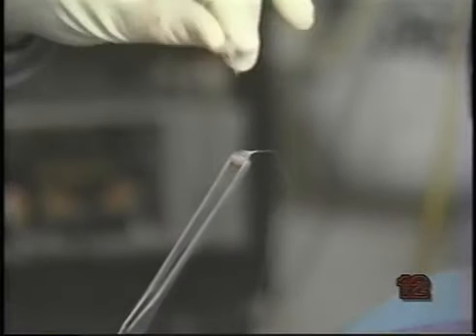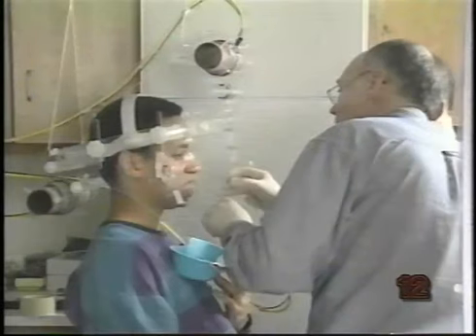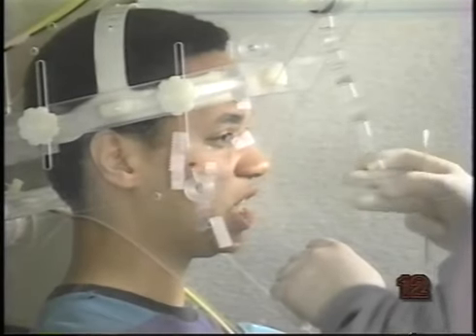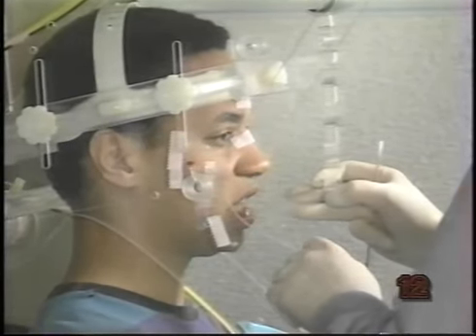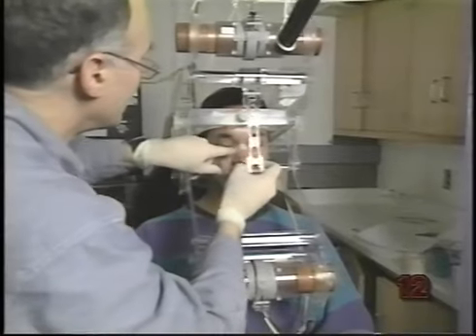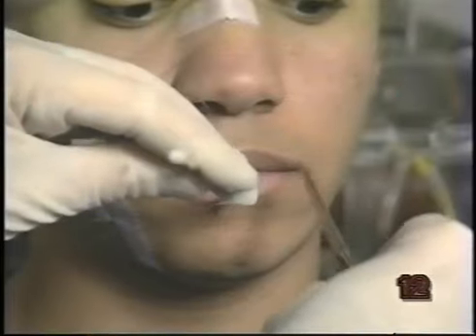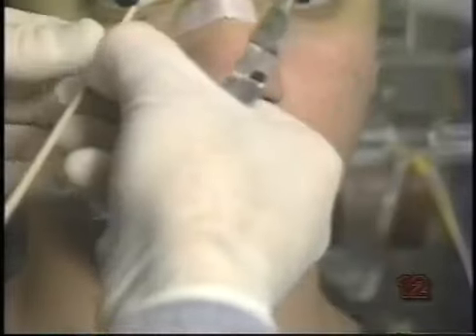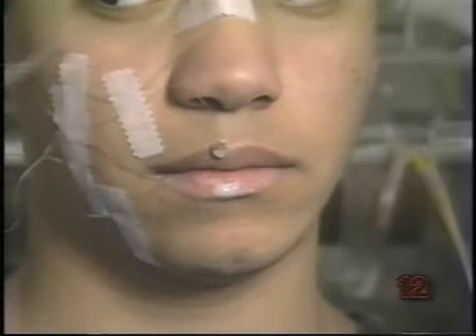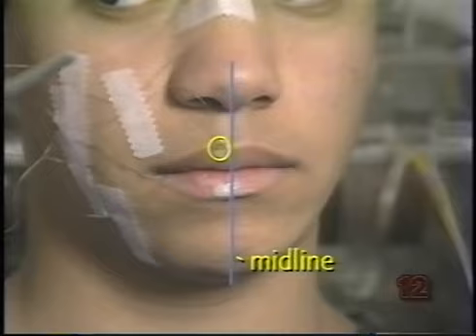In addition to accurate calibrations, the integrity of the data depends very much on the careful placement of transducers on the subject. We check each placement to be sure that no transducer is more than 3 millimeters from the midline, because the misalignment correction algorithm is increasingly less effective with transducer placements that are further from the midline. This time, in attempting to provide a clear view for the video camera, we placed some transducers unusually far to the subject's right, very near the tolerable limit. Normally, we would reposition these transducers.